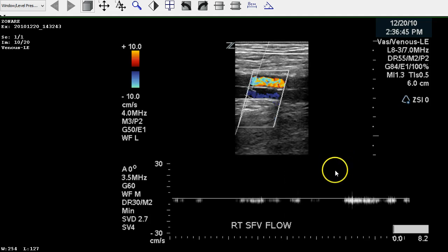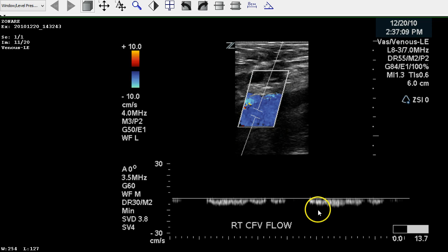We move back up the leg looking at the femoral vein, and we see that there's decreased flow along the baseline and decreased color flow within the vessel itself. All of these are key indicators that there is occlusion. The common femoral vein also has decreased flow — it doesn't appear to be fully continuous, there are some breaks, but there is definitely decreased flow throughout that vein.